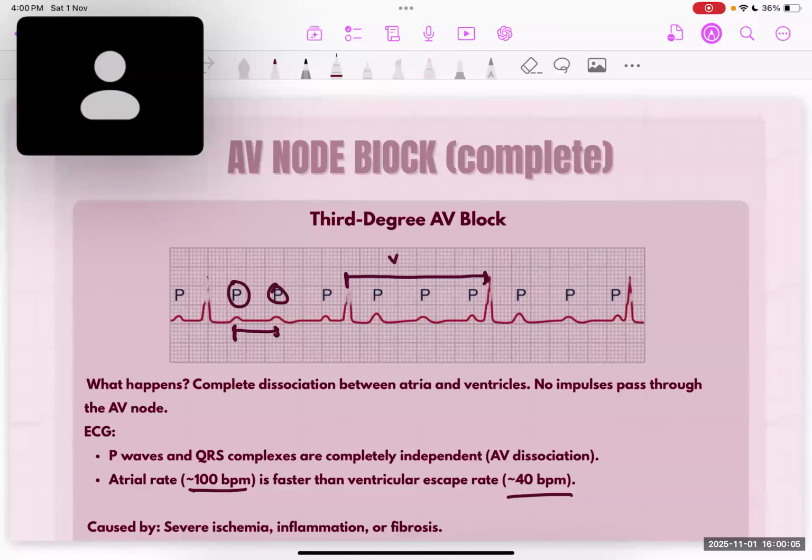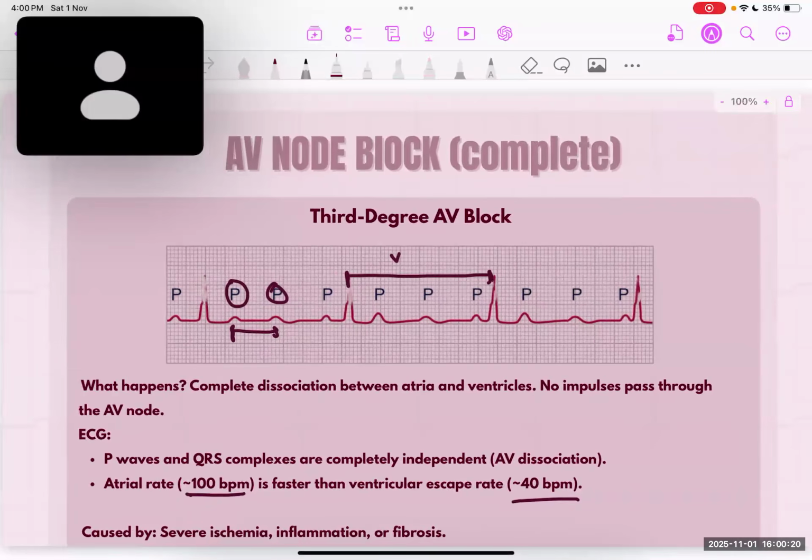So you're not gonna see the normal ECG with the PQRST. You're just gonna see two waves. We can just use the big blocks method. So we have 1, 2, 3, 4, 5. Sometimes it's not really a QRS, but yes, it is. Where would you define the T wave? So it's not connected. They're very disconnected from each other. They're gonna be beating and they're gonna have their own rates because the connection between them has been blocked completely.